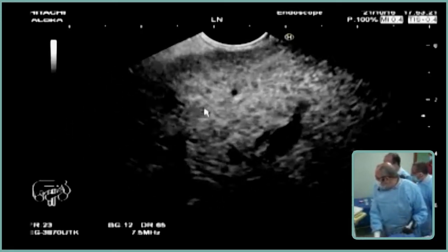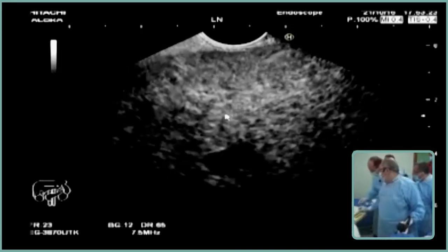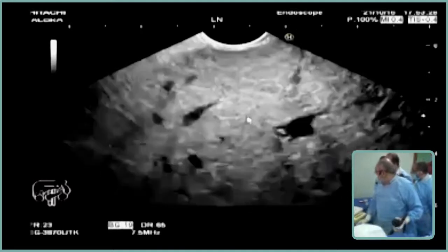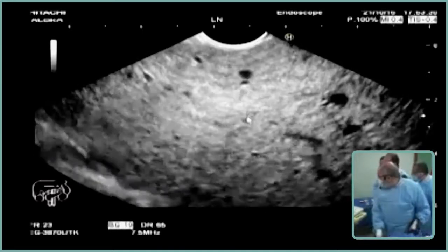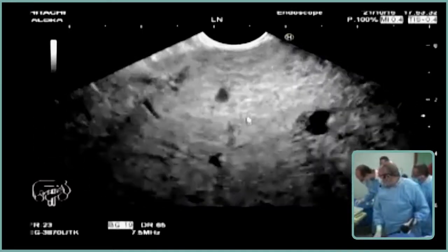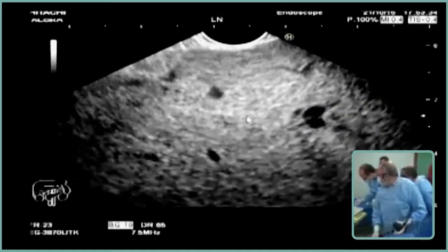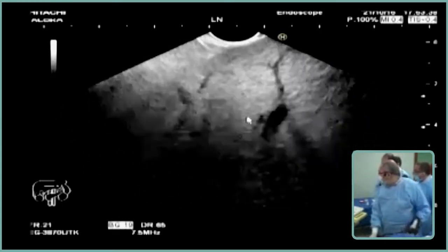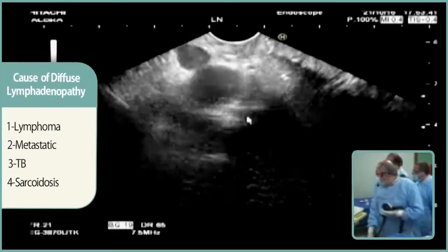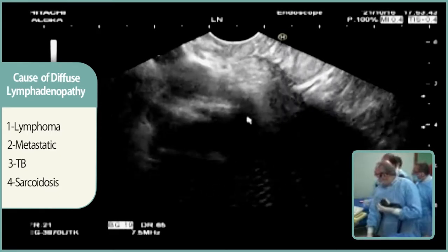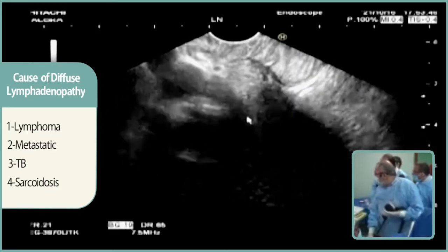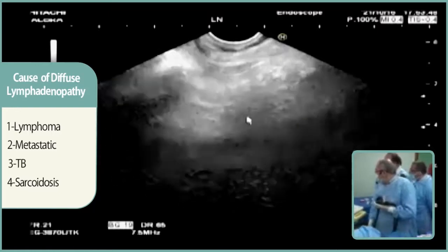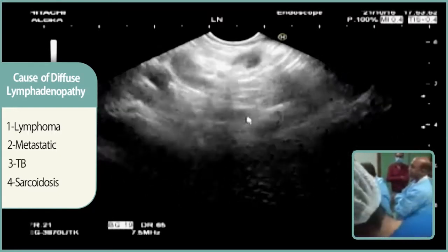This liver appears as if it is infiltrated — there are multiple minute focal lesions. When we see lymph nodes, we always remember three or four causes: lymphoma; metastatic as malignant; and TB and sarcoidosis as specific benign. These are the most common causes of lymphadenopathy.